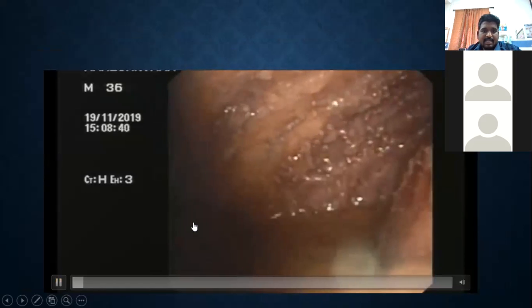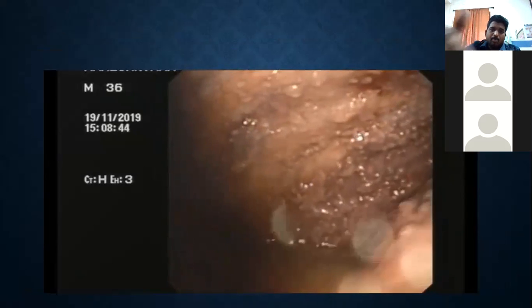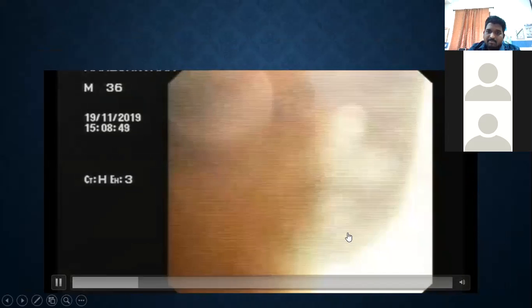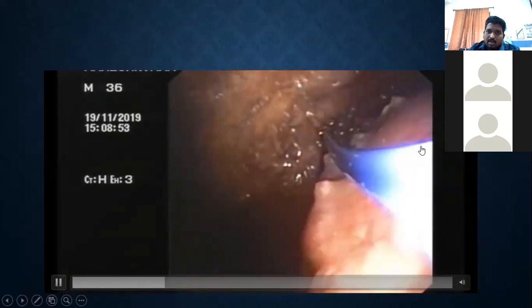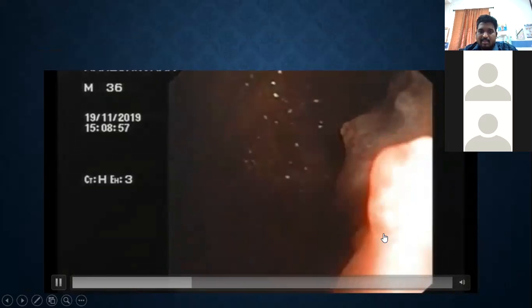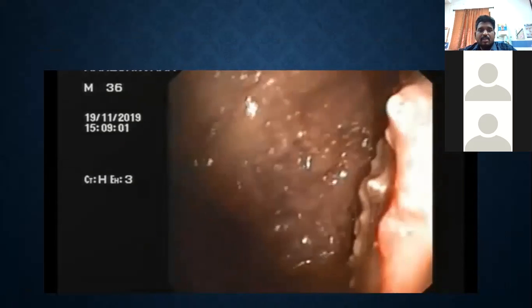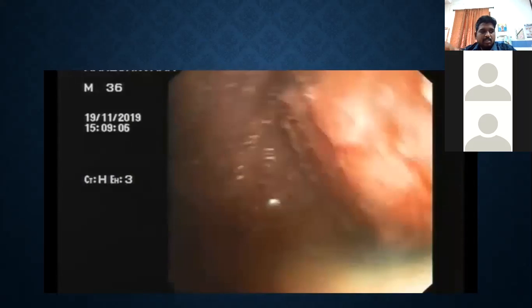And once again, this is a case. You could see the parietal pleura above here, effusion here, and you see the diaphragm. The diaphragm is moving up and down. You can see that, and over the diaphragmatic pleura, a lot of nodules are there. So this type of thing, manipulation, you should not do, like what was shown in the picture. You should always take your thoracoscope very close to the area where you want to biopsy. So the biopsy forceps should not bend.